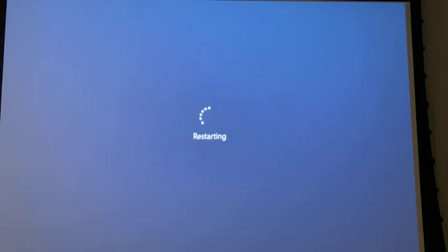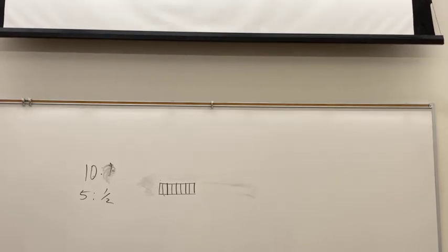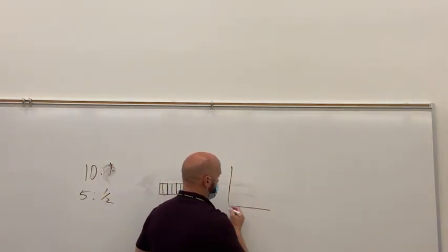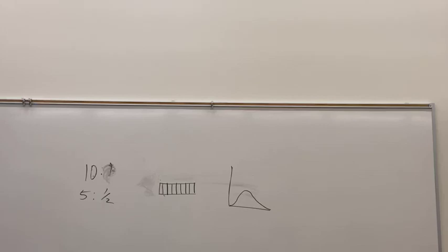It increases the energy level of the minimum, and it decreases the numbers, so the height comes down, and it pushes the beam spectrum towards the high energy side. If you increase filtration, let's say you've got one beam spectrum, looks like that, and really the technique doesn't matter.